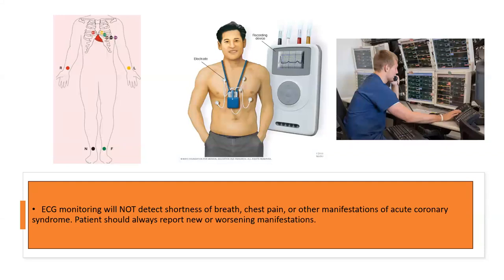Continuous cardiac monitoring requires the patient to be in close proximity to the monitoring system. Whether it's a Holter device where they carry it with them, or a tele, there has to be some sort of connection to the machine. With your 12 leads, the machine is right there with them. They'll bring the 12 leads to the patient's room.